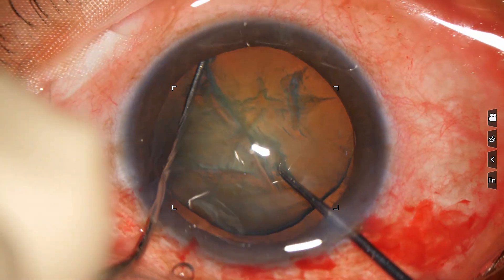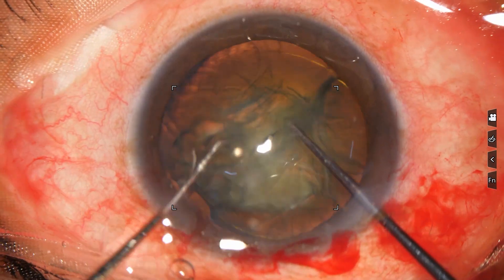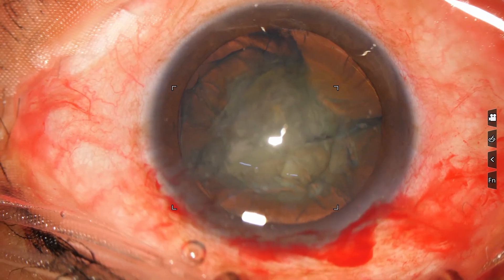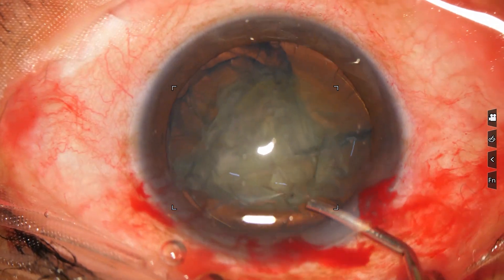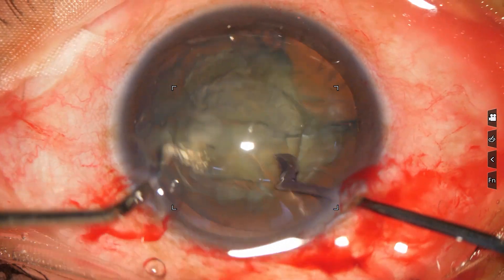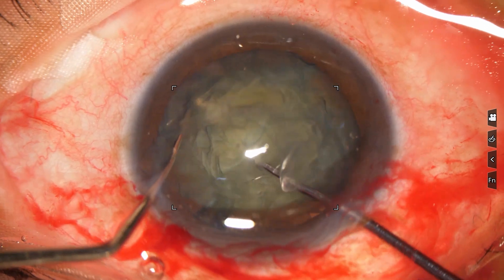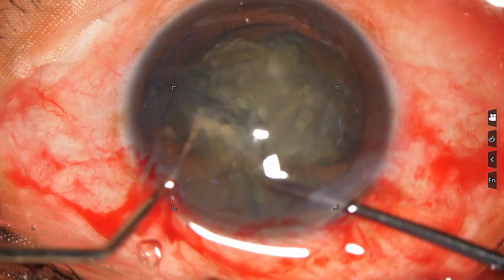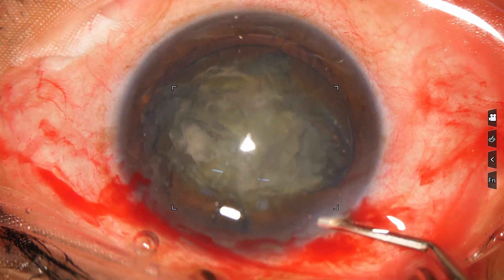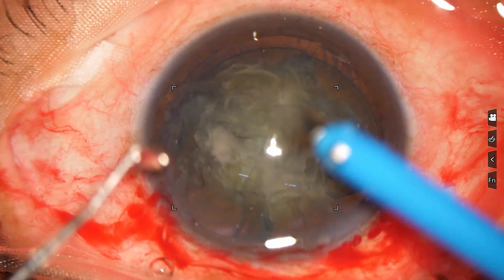If we use a pre-chopper in such cases, the use of ultrasonic energy is less, and this grade 2 plus nuclear sclerosis — this kind of nuclei can be easily divided by the pre-chopper. In hard cataract, we can hold the nuclear mass very well with the phaco handpiece, so in those cases the use of pre-chopper may be avoided.